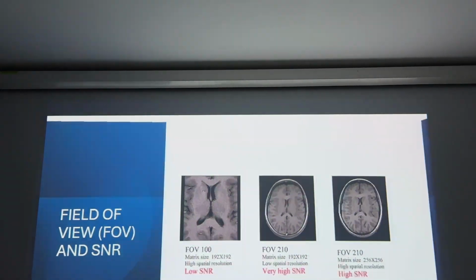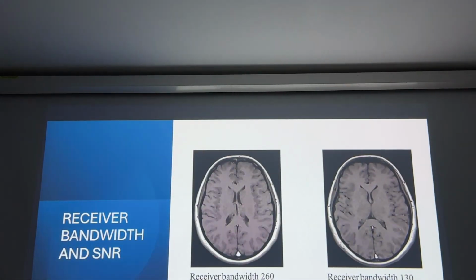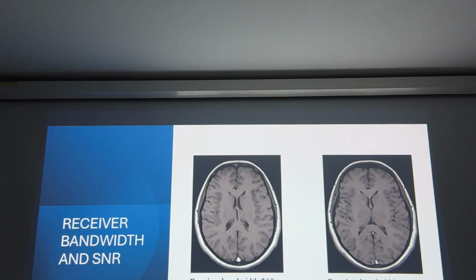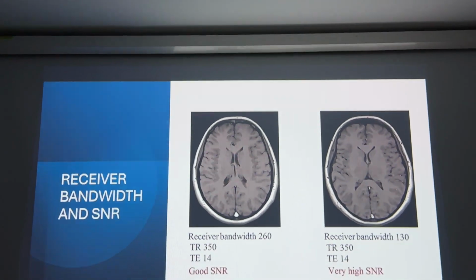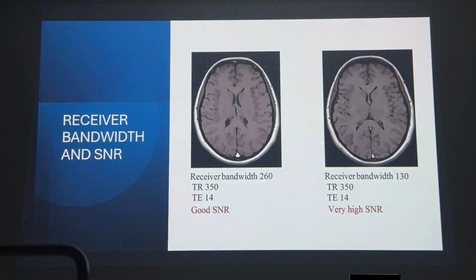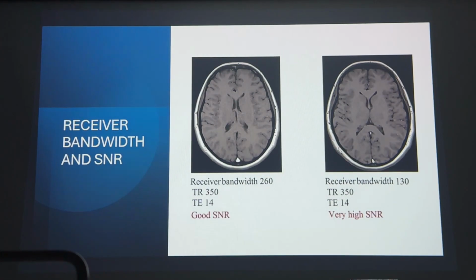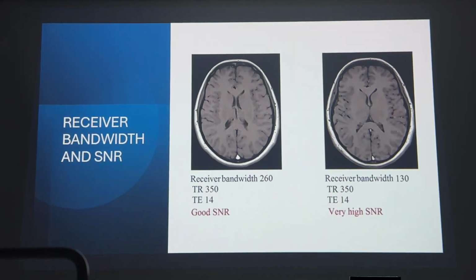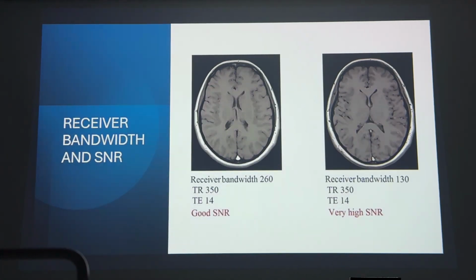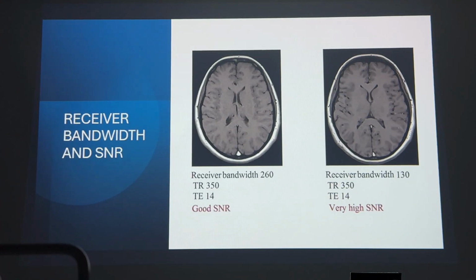The bandwidth. Every operator in MRI knows that increasing the bandwidth will reduce the time of examination, but in relation to the signal to noise ratio, increasing the bandwidth will reduce the SNR, and decreasing the bandwidth will enhance the SNR and enhance the image quality.